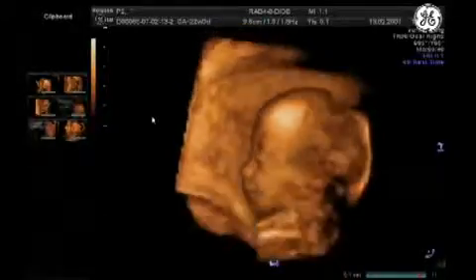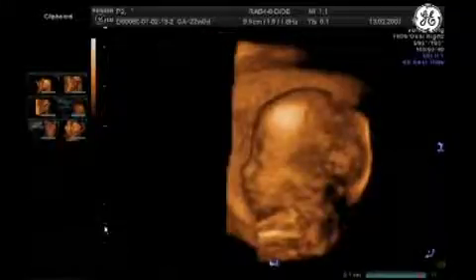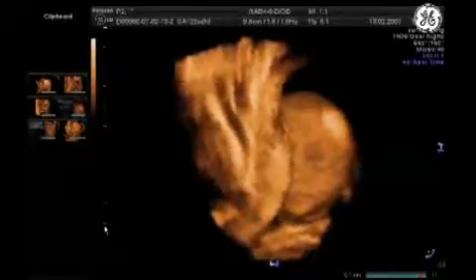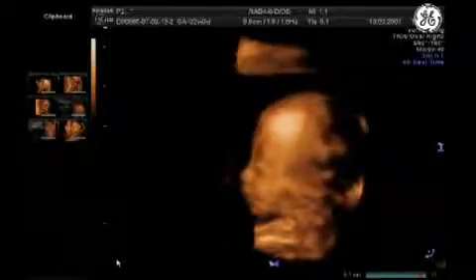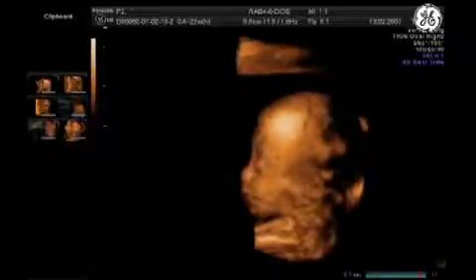You cut a part here. You try to obtain the face view, and you cut middle of the face, just behind the middle line. And when you turn, you have the profile with a black background.